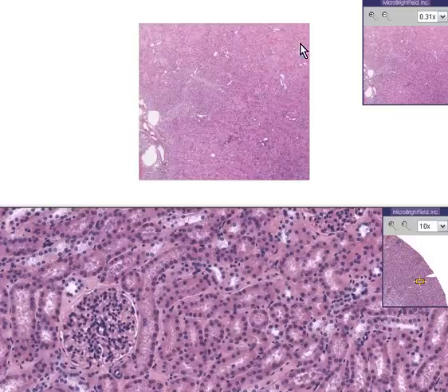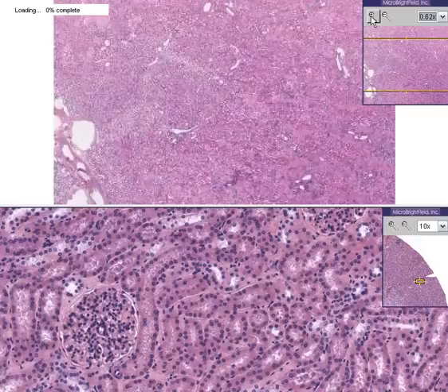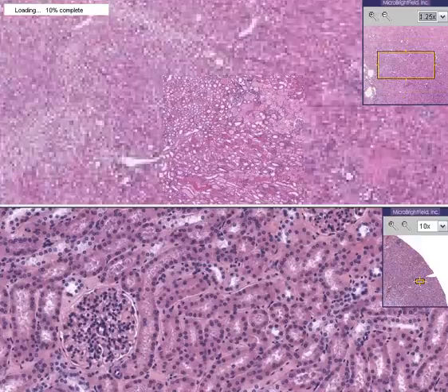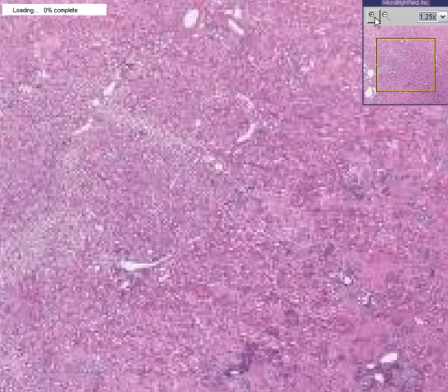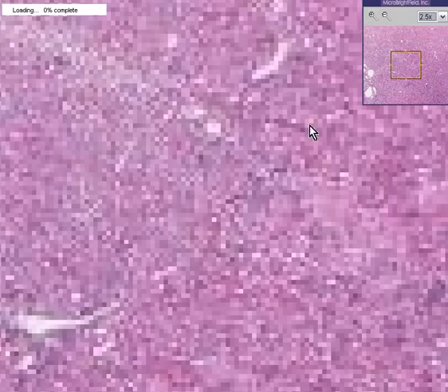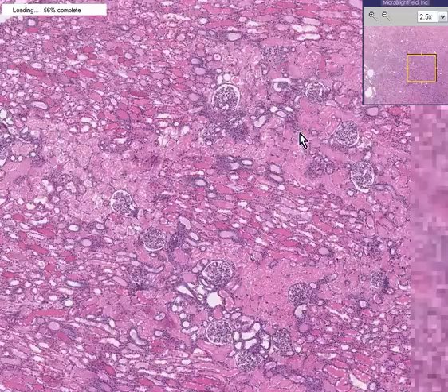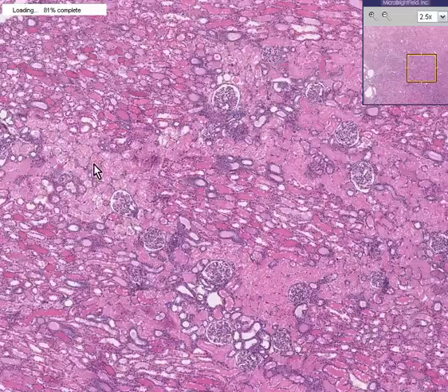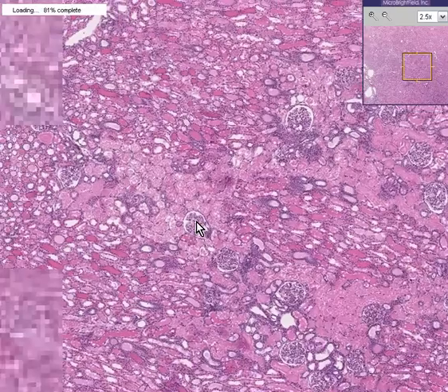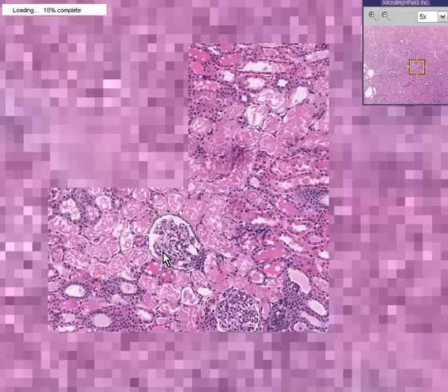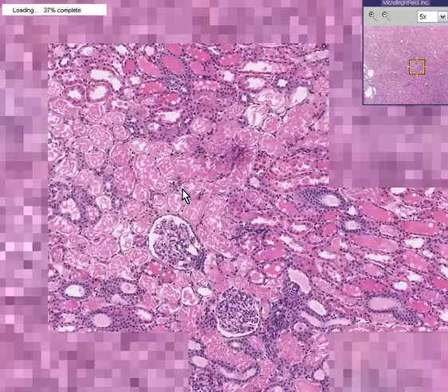This is a normal kidney. Now here's our abnormal kidney in question. Let's zoom in on it in a big way. We can recognize it as kidney, and we can see some glomeruli — one, two, three, four, five, six, seven, eight. But notice there seem to be very pale areas around these glomeruli. It's pale because the tubules are necrotic.